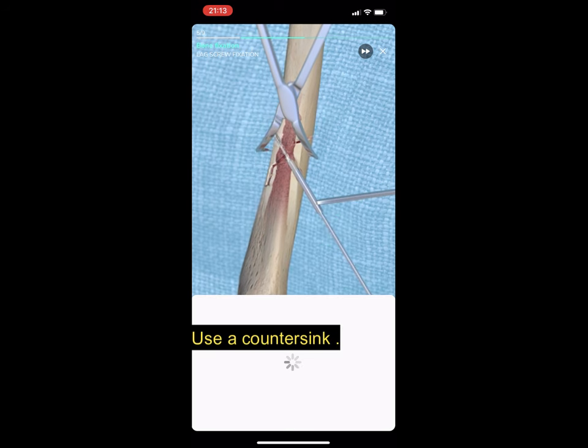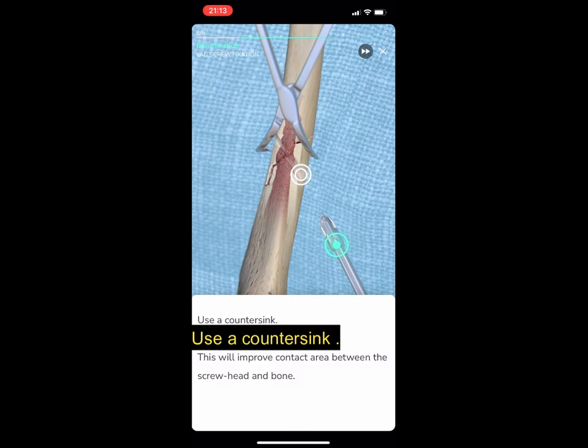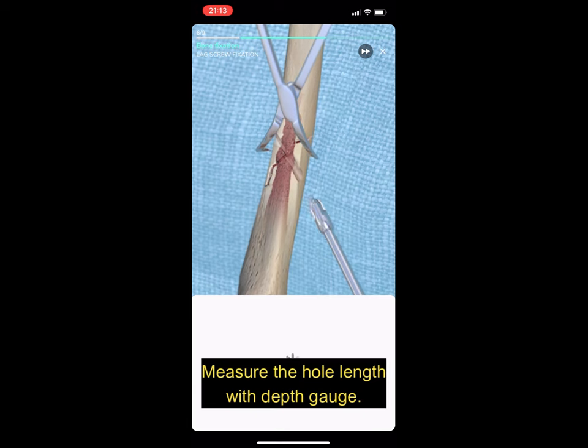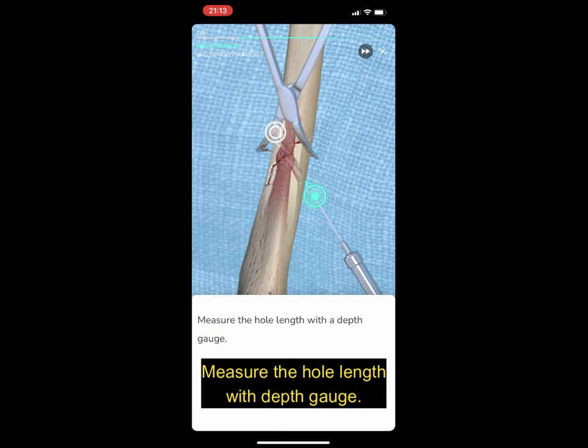Use a countersink. Measure the hole length with a depth gauge.